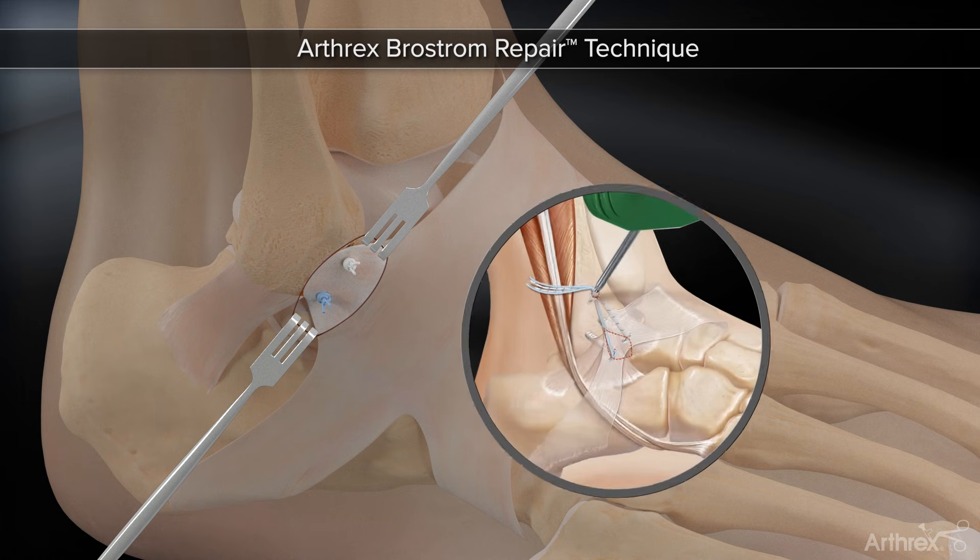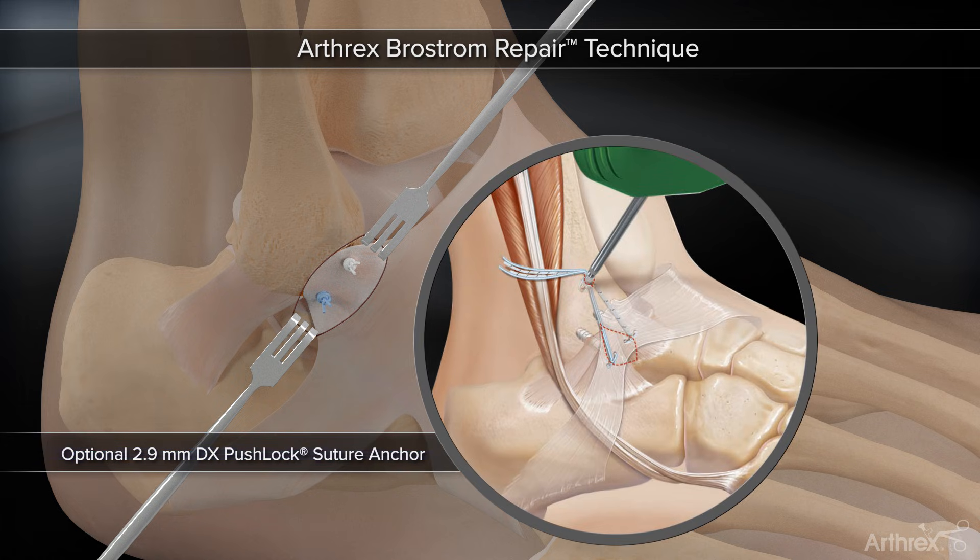To further enhance the repair with an additional 40 N of time-zero construct strength, a 2.9 mm DX pushlock can be inserted 3 cm proximal to the distal tip of the fibula. Incorporate all four sutures from the completed Arthrix Brostrom repair into the pushlock and seat the anchor flush with the bone.